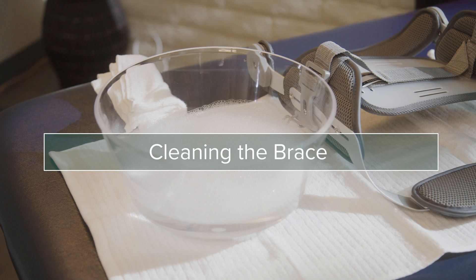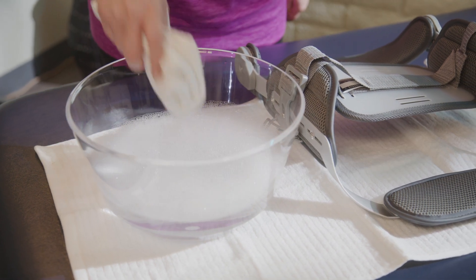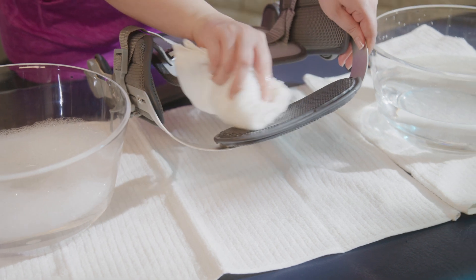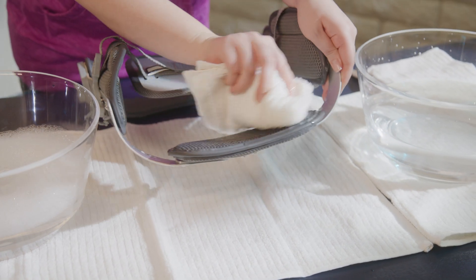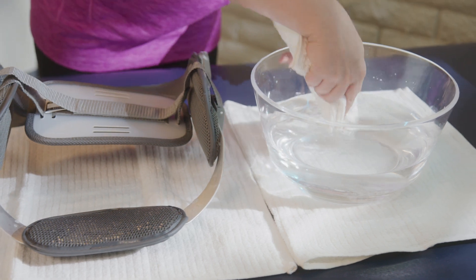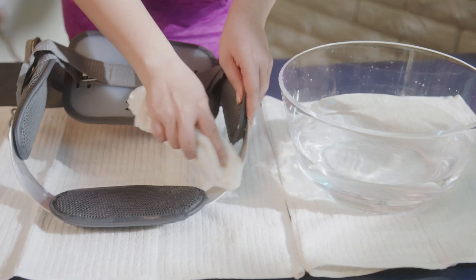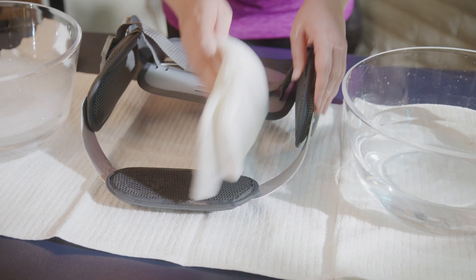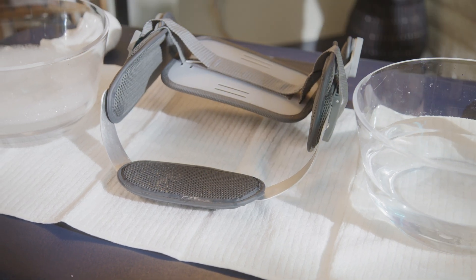To clean the Sierra Hyperextension TLSO pads, wipe with a damp cloth and mild soap. Wipe off excess with clean water. Allow to fully air dry.